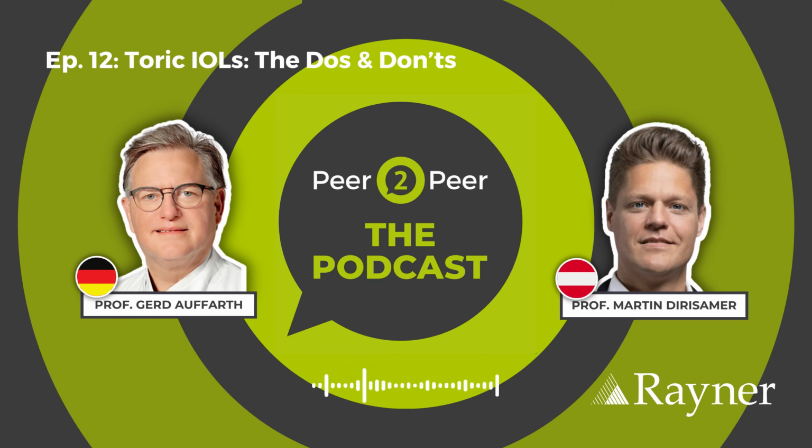this amount of astigmatism. So do you have a preferred method? What do you trust more, your IOL Master or your Pentacam? Neither to 100%. It's a very good question, because there are some studies showing that the IOL Master has advantages, but there are also studies showing the Pentacam probably shows more precise measurements, because the posterior part of the cornea is also taken into account. I think it has to fit together and make sense.